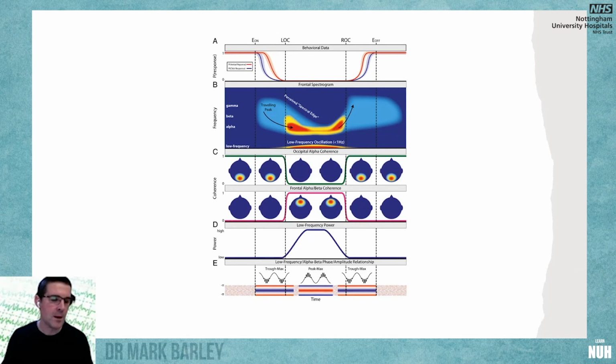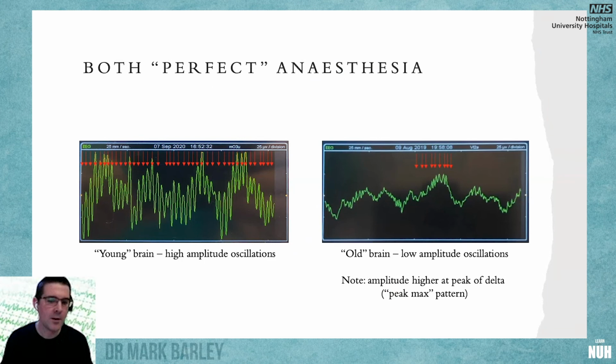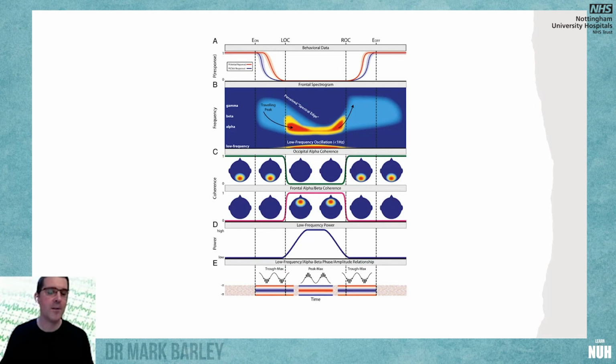And then this is looking at those alpha oscillations that we just mentioned. During periods of unconsciousness, the alpha oscillations are largest at the top of the wave, and then as we get a little bit lighter, they're largest towards the bottom of those delta waves. A little bit like here, we can see they're very large at the top of that oscillation, but quite small towards the bottom. In this case, they're just big everywhere, really. But both of those would be very satisfactory. This is a bit difficult to pick up in every case, but very satisfying when you do see it.